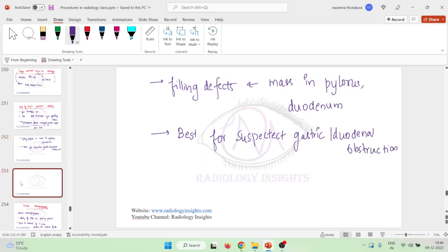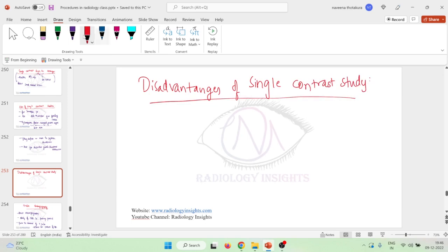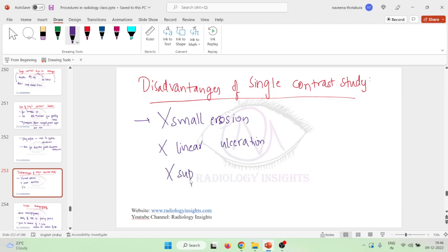Now, okay, this is good. Then what are the disadvantages of single contrast study? The main disadvantage is that it does not have the necessary sensitivity for very small lesions. So it cannot detect any small erosion, or it will not detect the presence of any small ulcerations or linear ulcerations. It cannot detect any superficial gastric carcinomas.